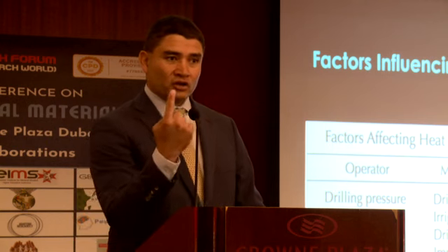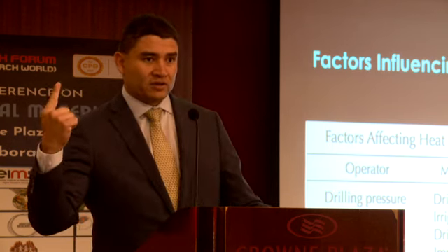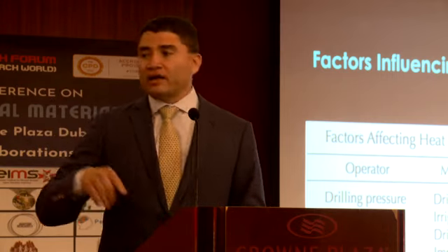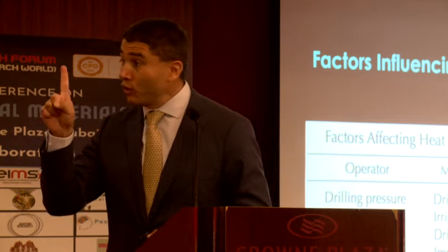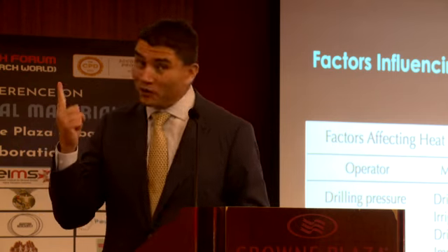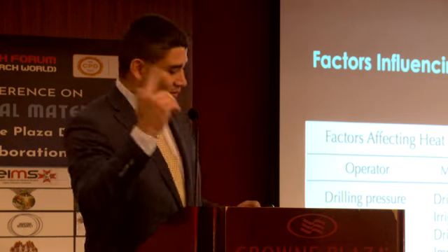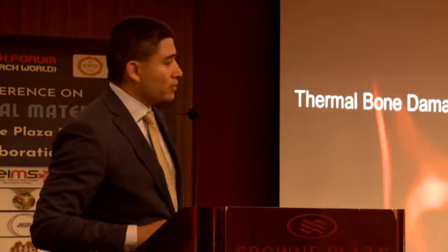The drill that I should use one time, I use it 100 times. It's until I really cannot drill anymore that I tell my assistant, oh, could you order me another drill? But only one, not many, only one, right? Well, when do you change the drills? We want to see that as well. So let's look at the thermal bone damage.